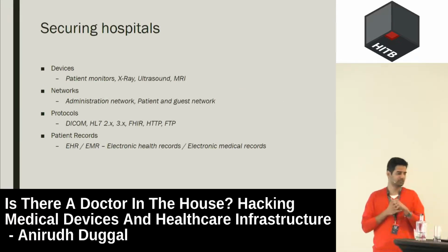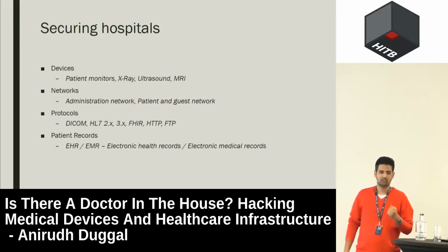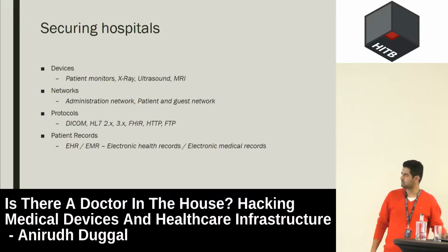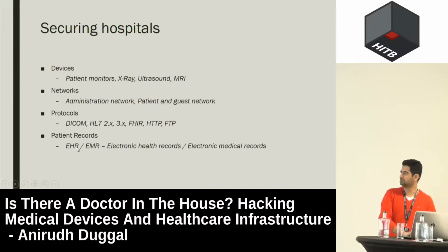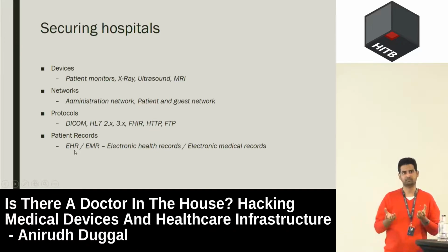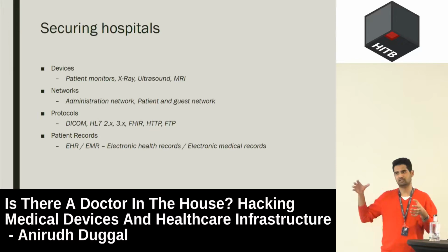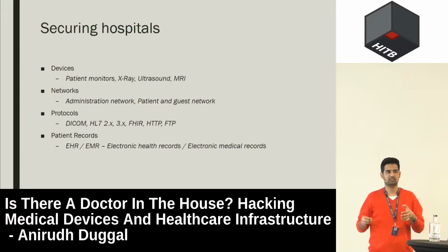All right, so let's talk about securing hospitals. If you look at hospitals, there are devices, there are networks, there are protocols, and there are patient records. These are the terms that we will be using. Just remember this guy over here, which we call EMR, EHR. This is like the center of the hospital system. All the patient database, anything that goes into the hospital from your patients or records, from your doctor's machine, is fed to the EHR or EMR.